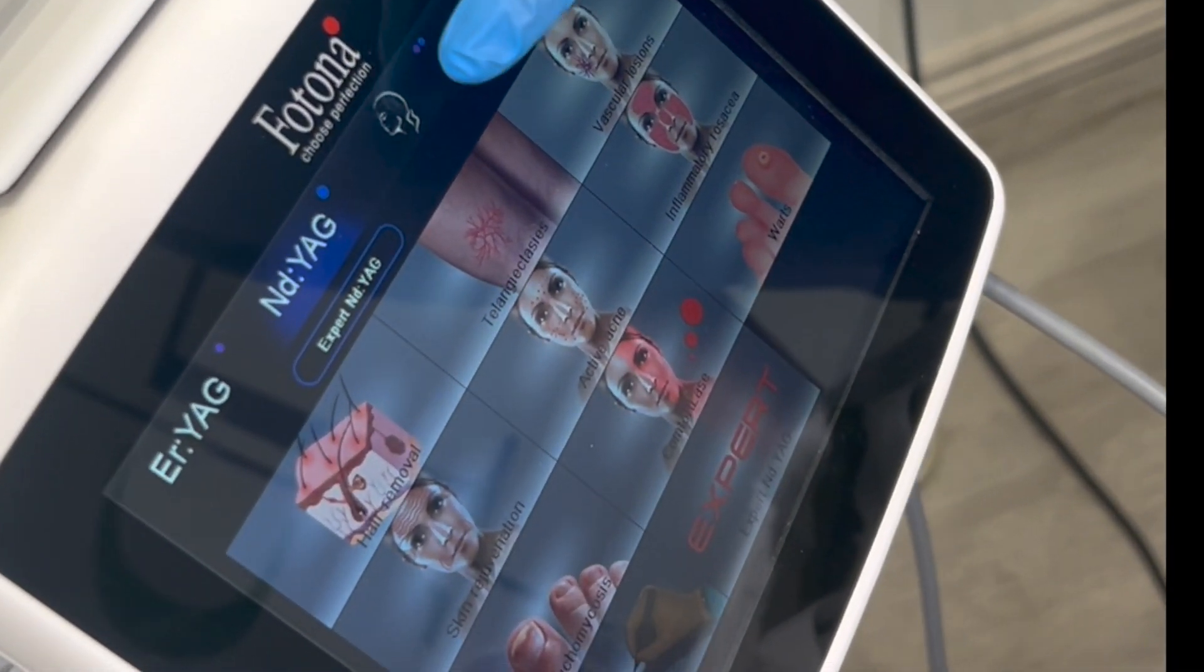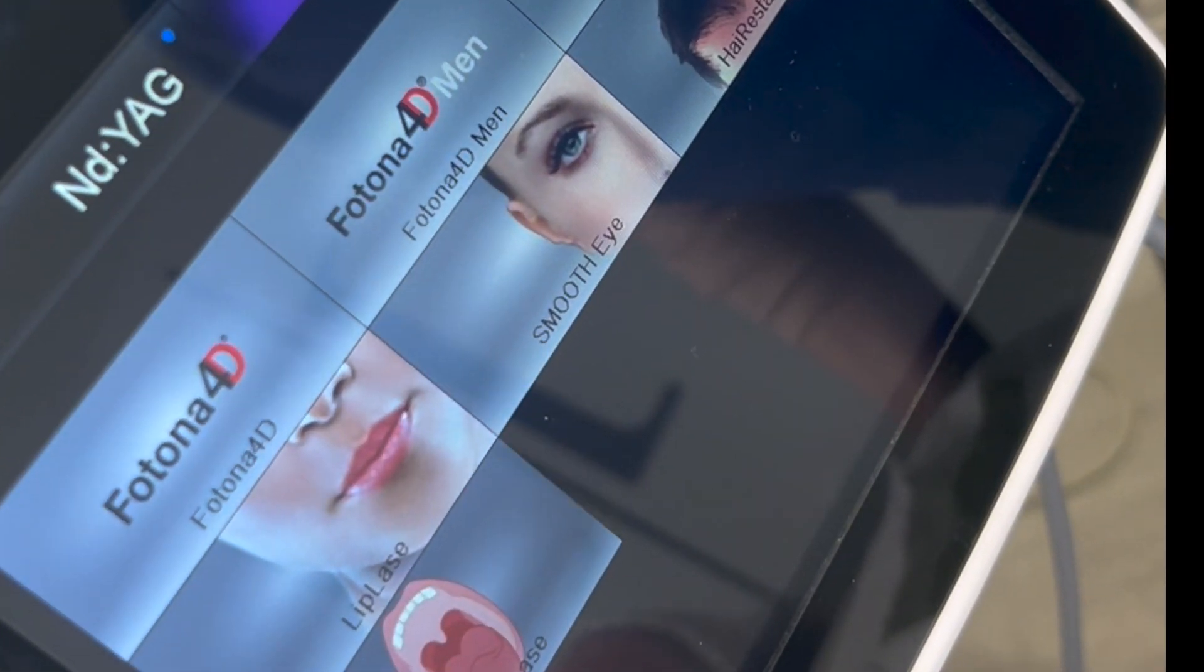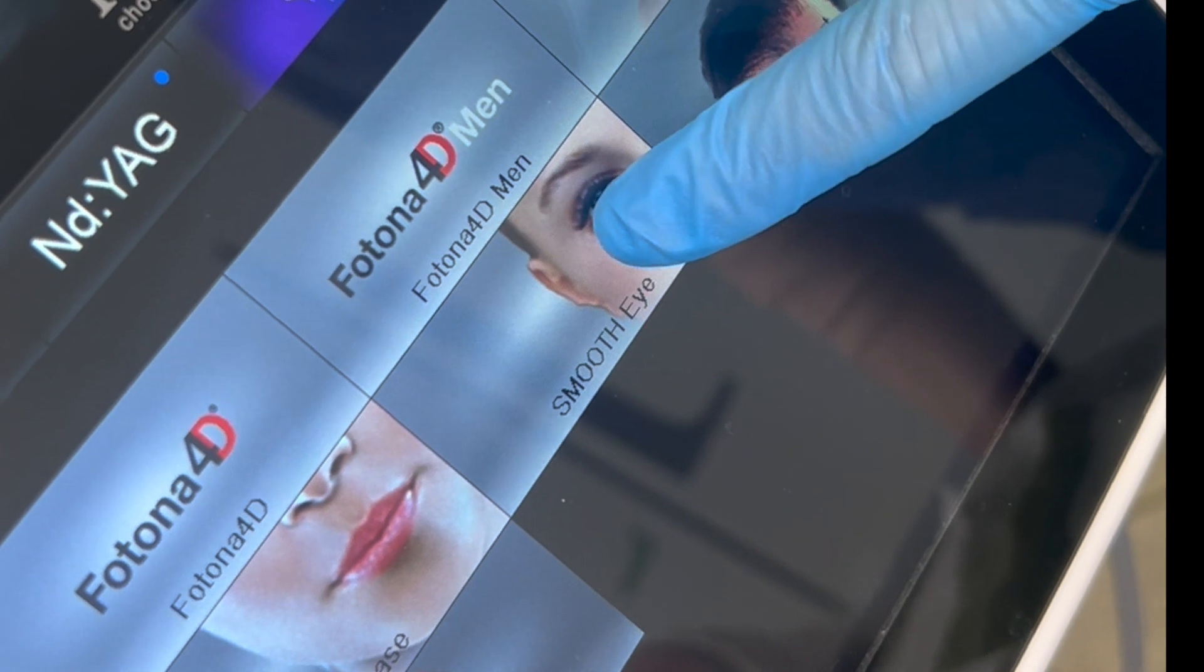We're now going to the twin light option on the interface and finding smooth eye and selecting that treatment.